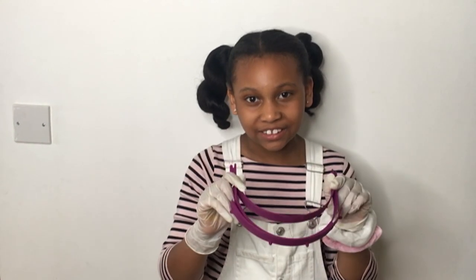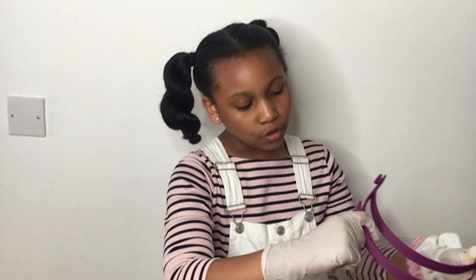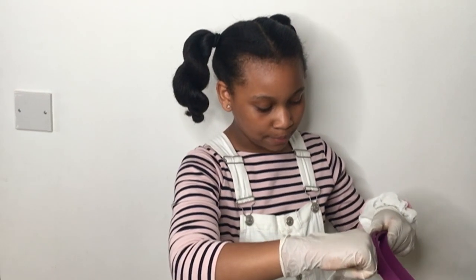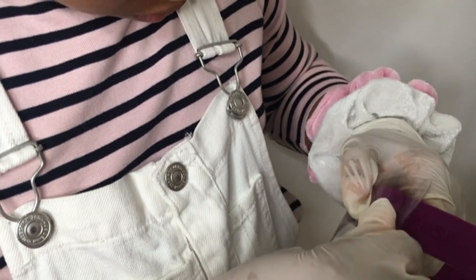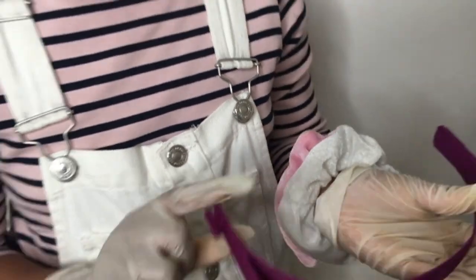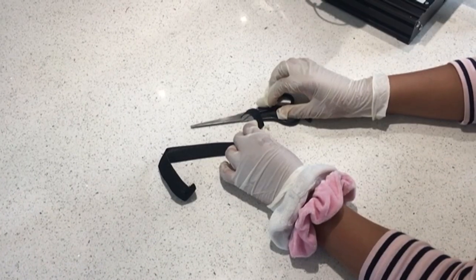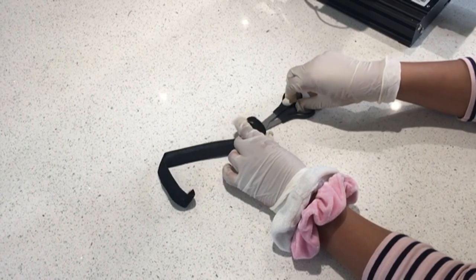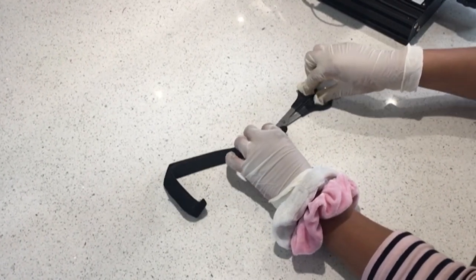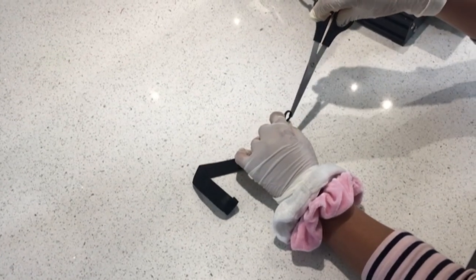Once your headband has finished printing, it should look like this. After that you need to attach your plastic acetate to four nodules at the bottom of your headband. The next step is to take your elastic and make two small holes in them, one on each side. I do this by folding my elastic and making one small snip on each side.